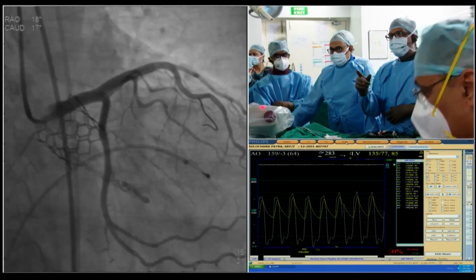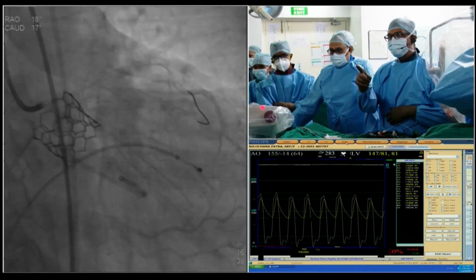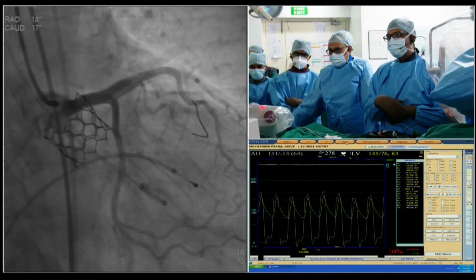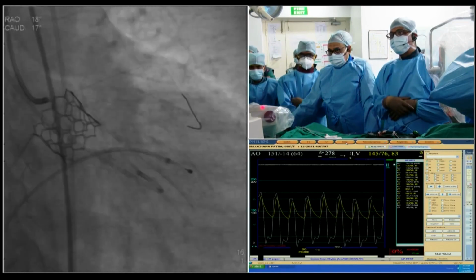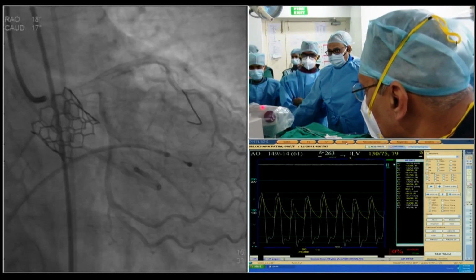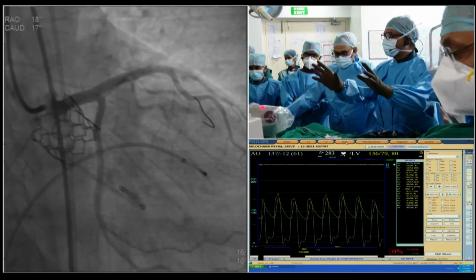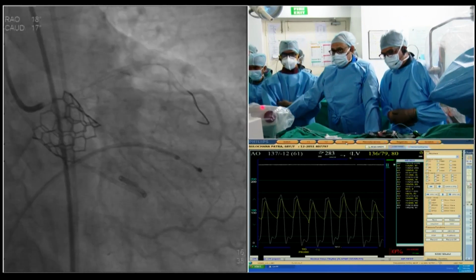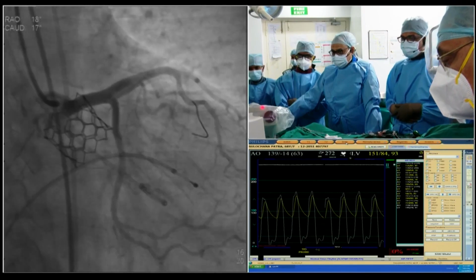So go forward one picture. Go forward, sir. Yeah, so this picture is without the guide liner, and go back. And there's one picture with and without the guide liner, Amit. So this picture, what you're seeing right now, there's no guide liner. Then it looks perfect. And you can see the EKG, move that back. Okay, so EKG is a narrow QRS and a heart rate of 85 with a regular sinus rhythm.